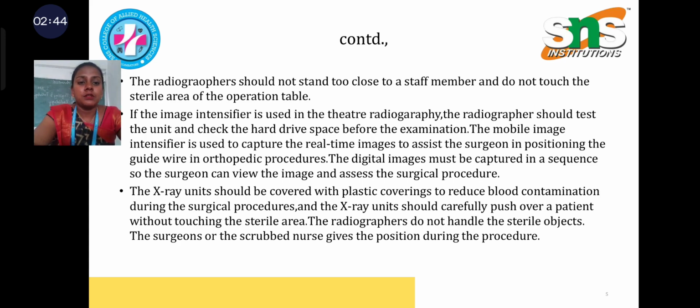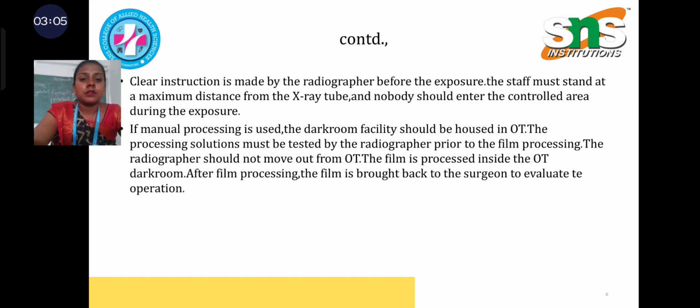The X-ray units should be covered with plastic coverings to reduce blood contamination during the surgical procedures, and the X-ray unit should be carefully pushed over the patient without touching the sterile area. The radiographers do not handle the sterile objects. The surgeons or the scrubbed nurse gives the position during the procedure. Clear instruction is made by the radiographer before the exposure.